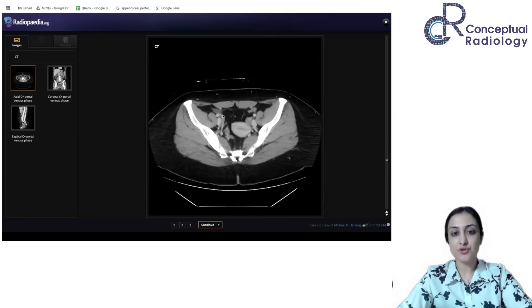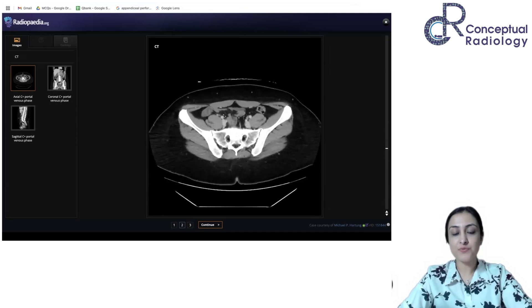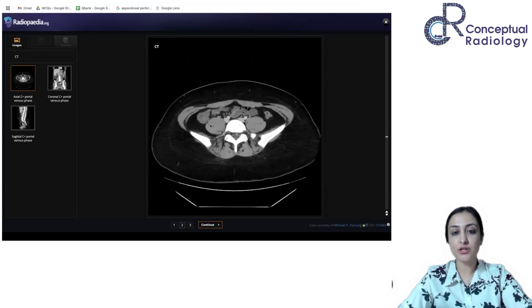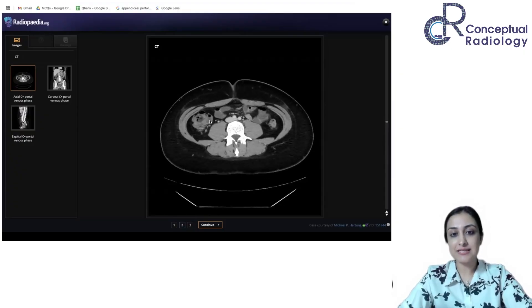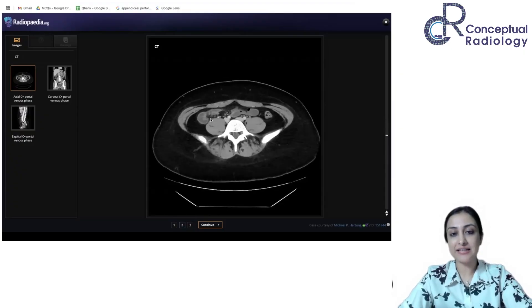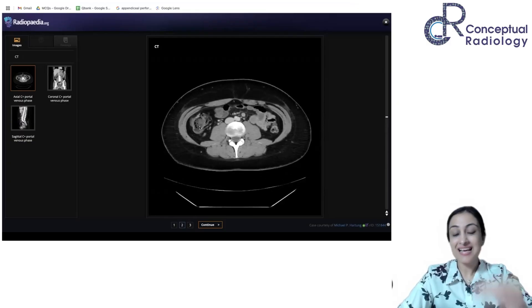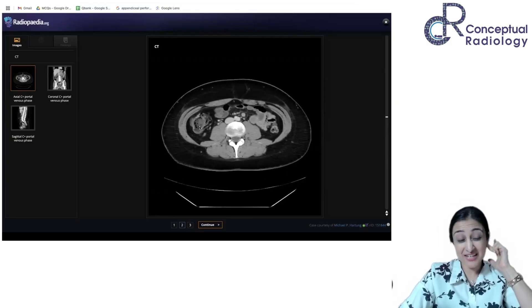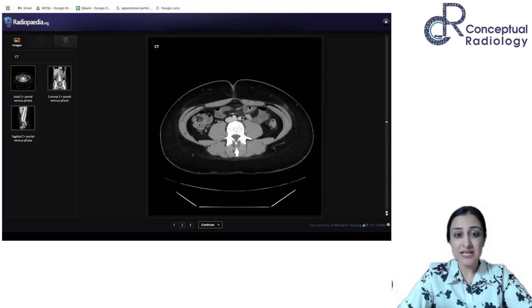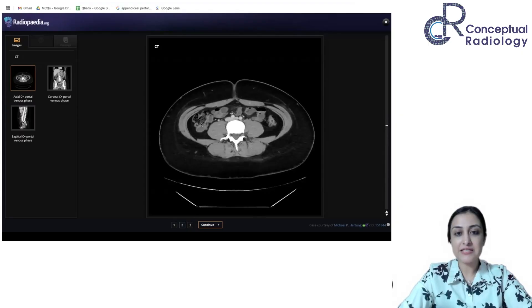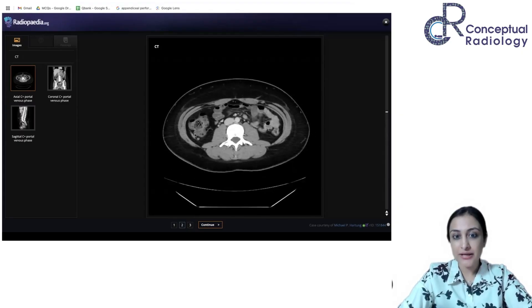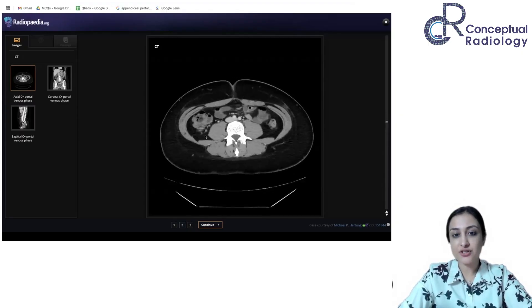After looking at all the bowel loops, let's go back to the terminal ileum. We now focus on the cecum — you can see this is the terminal part of the ileum, and this is the cecum. I'll show you the appendix as well. You can see terminal ileum meeting the cecum, and now look at this blind-ending structure.